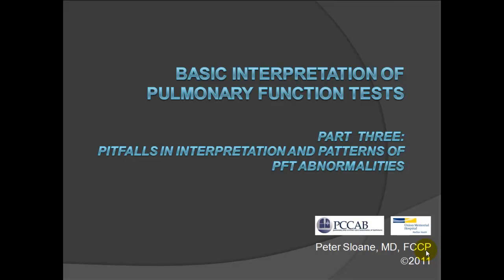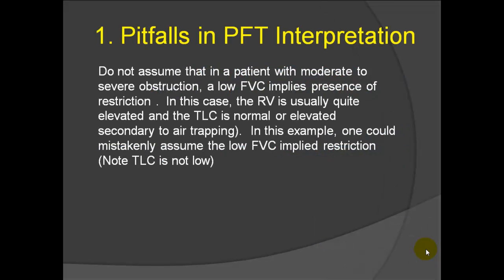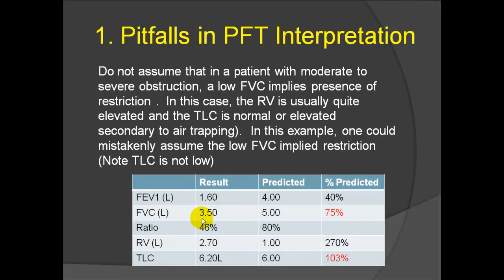In part 3, I'd like to review some common pitfalls in the interpretation of pulmonary function tests, as well as some common patterns of pulmonary function test abnormalities. First, pitfall. Best shown by the example below.